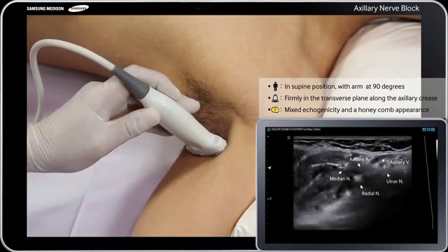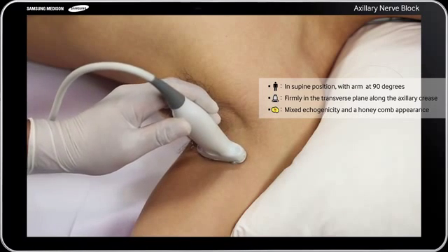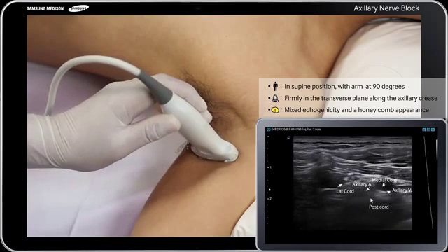Then optimize the system by selecting the appropriate depth of field within 1-2 cm, focus range usually within 1 cm, and gain.